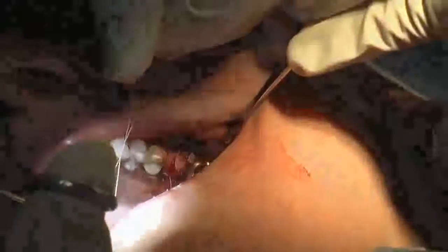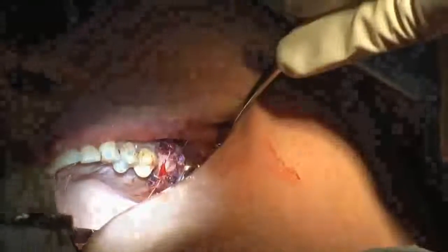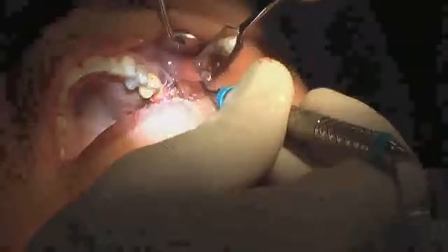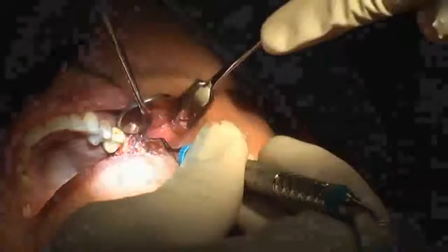This is just a retention suture. By going through the buccal gingiva, coming around, and going through the lingual gingiva, you're tying on top of the seal. This means you're not pulling the seal to the buccal or lingual side as you might with just one gingival margin. In this way it retains the seal, doesn't disturb the bond, and the seal can't come out after the bond between the gingival margin and the seal is broken.